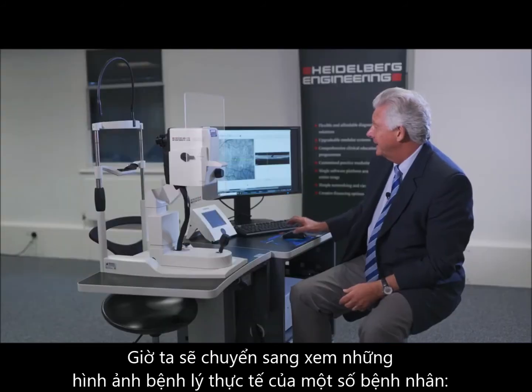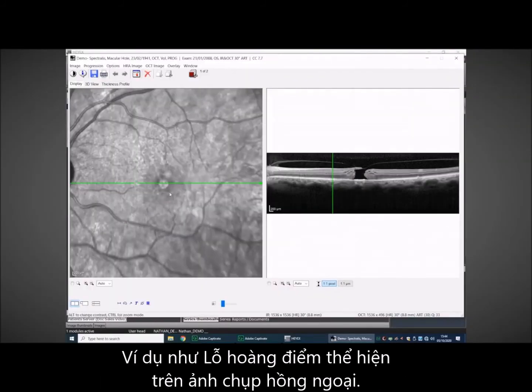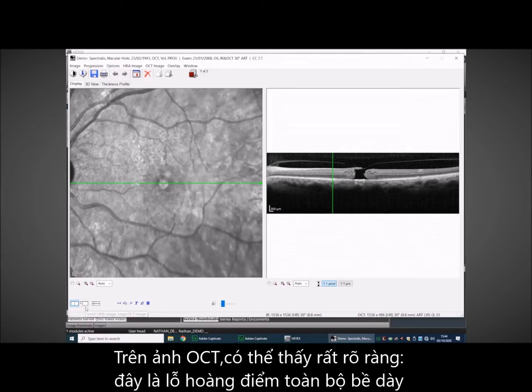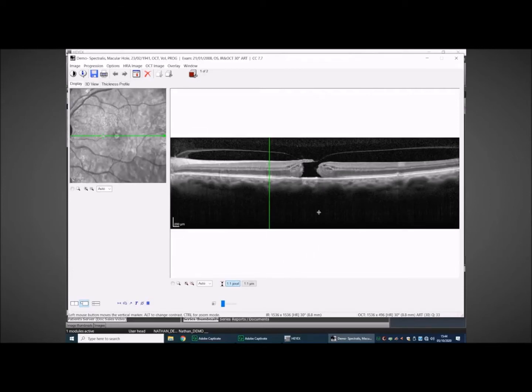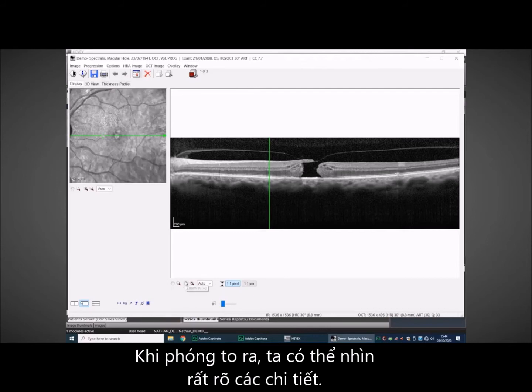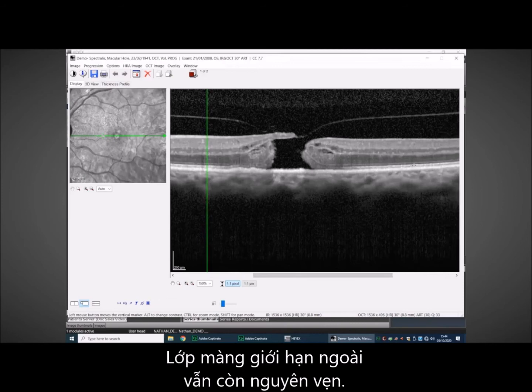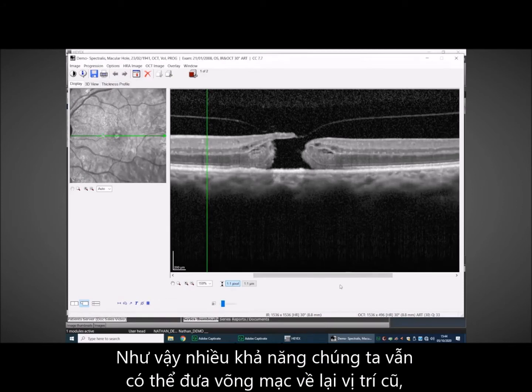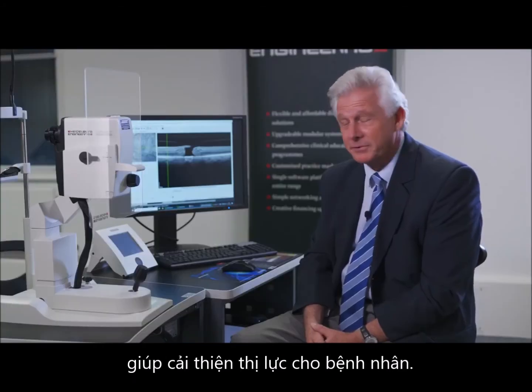reproducibility. Let's have a look at this patient here, which seems to have some pathology. Looks like a macular hole from the infrared reflectance image. And if we look on the OCT, we can see very nicely that it looks like a full thickness macular hole. We can magnify and look in great detail. We can see that the external limiting membrane is still preserved, and so there's a good possibility that if we can get the retina back in position, that patient might recover some vision.